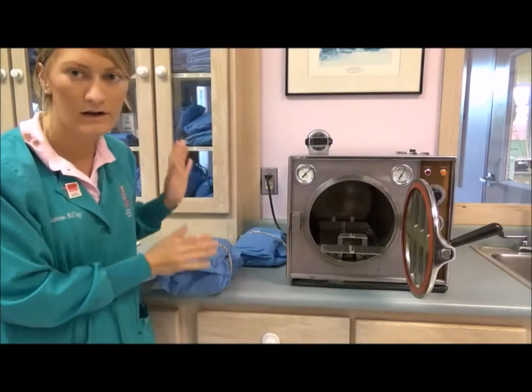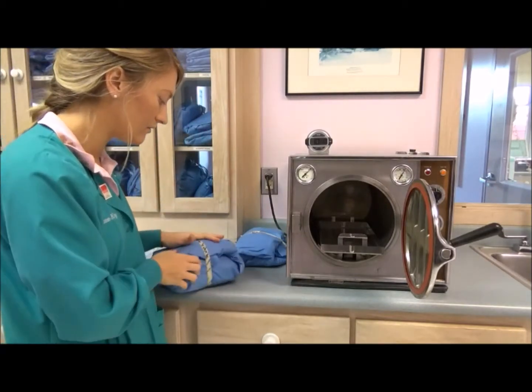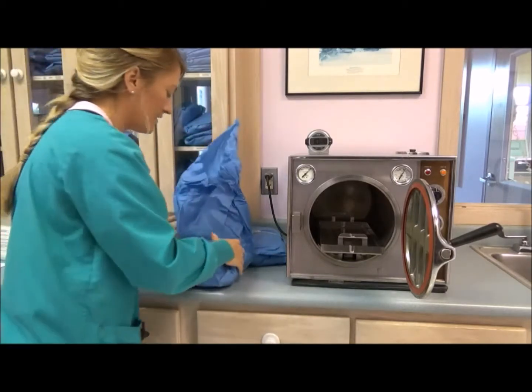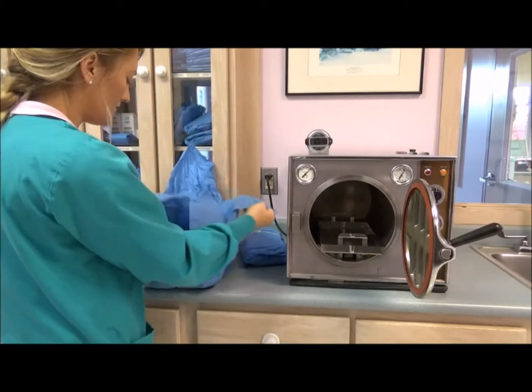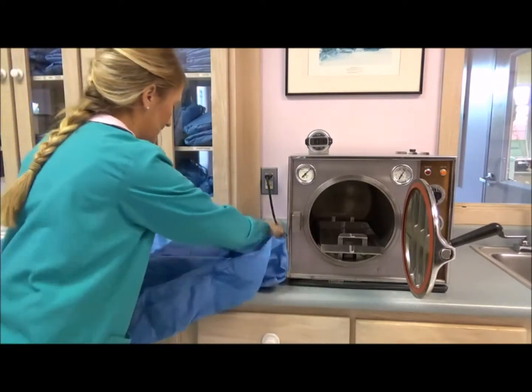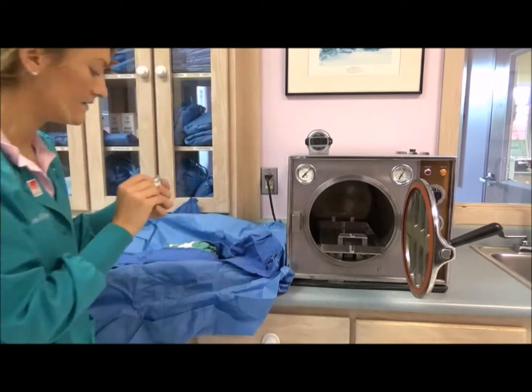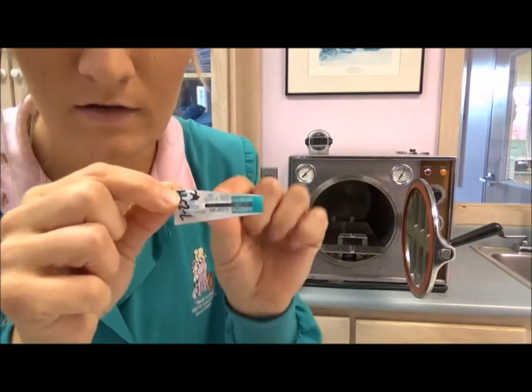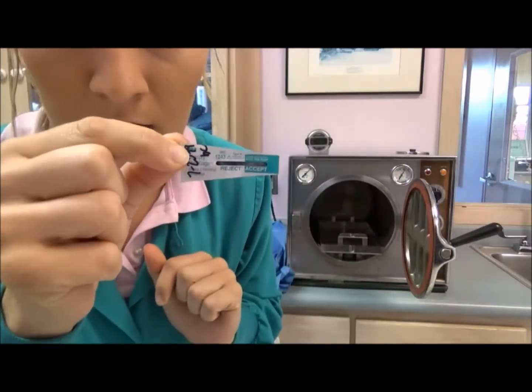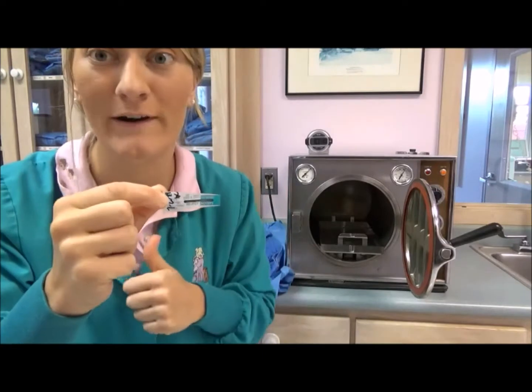But the surefire way to tell that the pack met proper sterility requirements would be to open the pack and check the steam indicator strip. So when you look at that strip, if the black mark reaches the acceptable portion, then that means that you met proper pack sterility requirements.